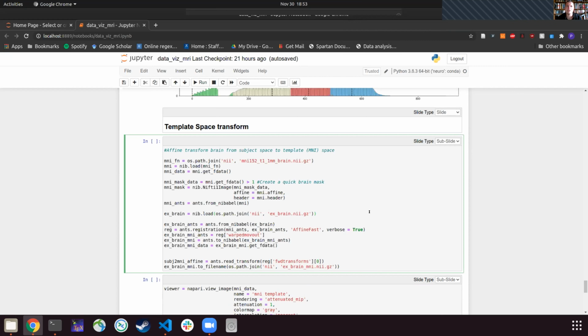But we want to keep the uniqueness of each individual brain. So it's a little bit of a tricky proposition, and we do lose some of the uniqueness of the brain through mushing them into a template space, but largely it beats the alternative, which is doing region of interest across 11 million voxels.